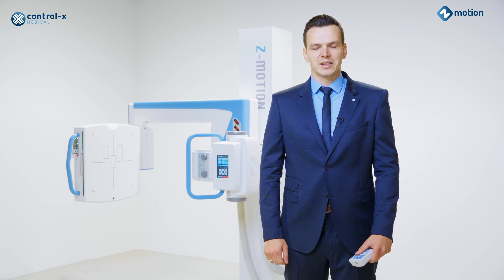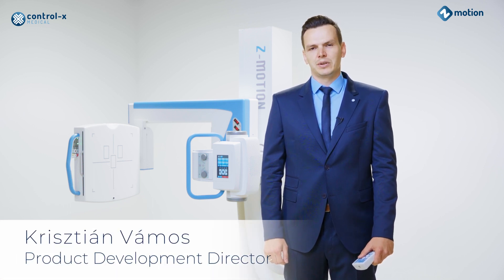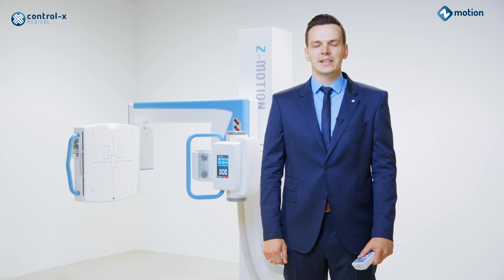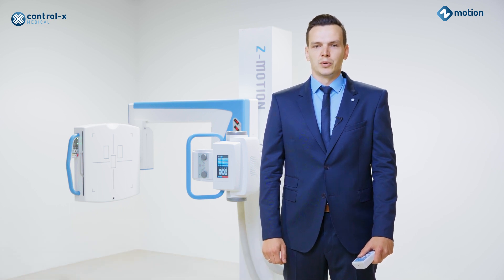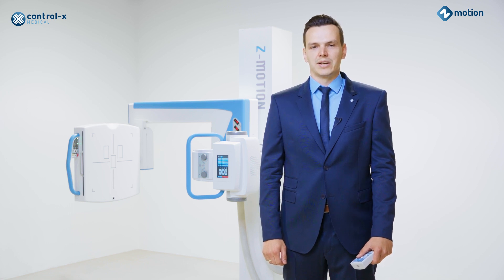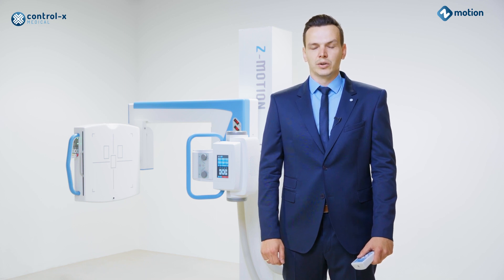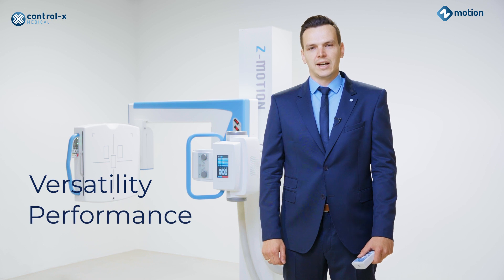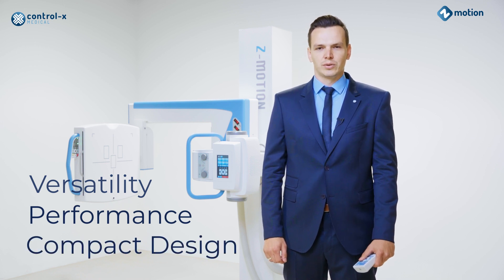Welcome to Control-X Medical, maker of high-quality radiographic systems. Today I would like to reintroduce to you our highly successful Z-Motion universal radiographic system. The Z-Motion is a Hungarian product grand prize winner and the customer favorite. We are excited to have the stand back in our portfolio and hope that its versatility, performance, and compact design will convince all those looking for a U-Arm X-ray solution.